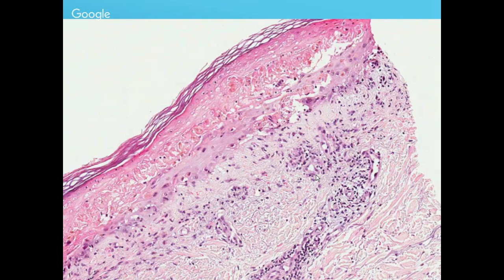And you might see eosinophils, you might not see eosinophils. If the erythema multiforme is related to a drug reaction, then you're going to see eosinophils. If it is related to a viral infection, you might not see the eosinophils. If it is idiopathic, you might not see the eosinophils. So eosinophils are not needed to make the diagnosis, but if they are present, they just tell you that the etiology most likely might be related to a drug. That is only important basically. So TEN will not be in the differential diagnosis? No, that is what we are coming to.